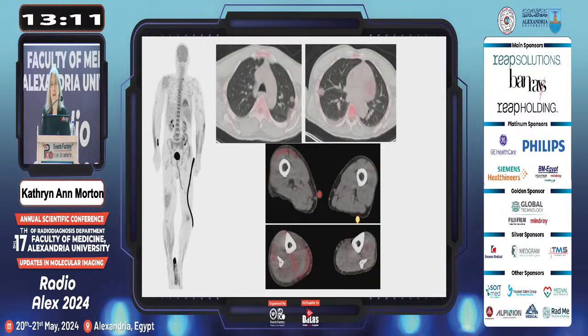So patients who present with either fever of unknown origin or more specifically with bacteria in their bloodstream, and this patient had methicillin-sensitive Staph aureus bacteremia, so they knew there was an infection somewhere. They didn't know where or what the extent was. And this FDG PET scan in this patient was very helpful.